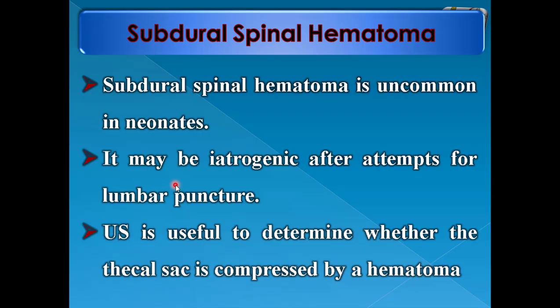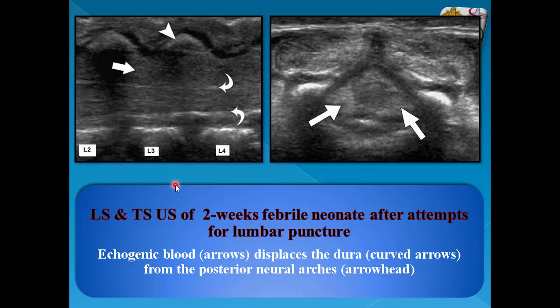Subdural spinal hematoma is uncommon in neonates but may be iatrogenic after attempts for lumbar puncture. Ultrasound is useful to determine whether the thecal sac is compressed by the hematoma. On LS and TS ultrasound images, this is the echogenic blood collection separating the dura mater from the posterior neural arch and surrounding the spinal cord. On TS the echogenic collection is blood.